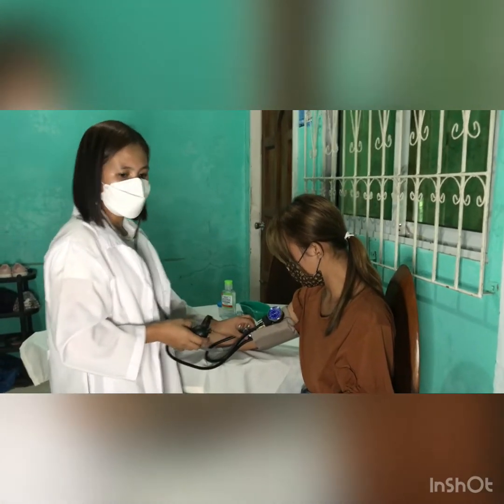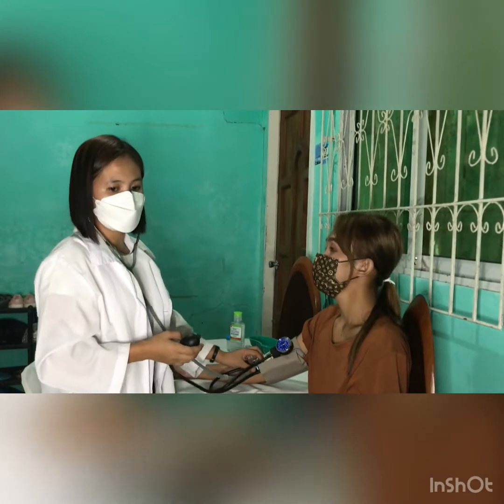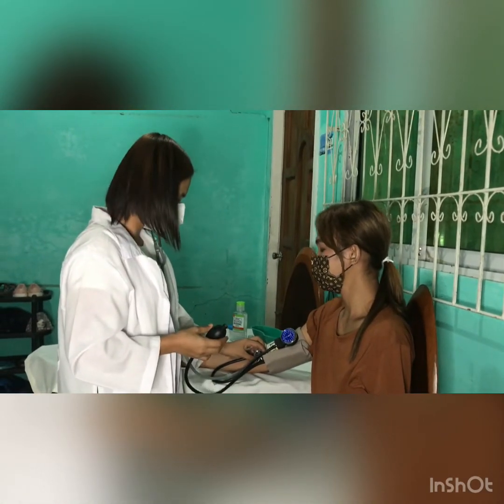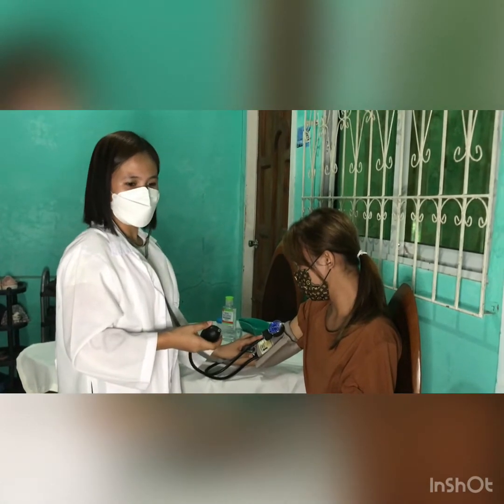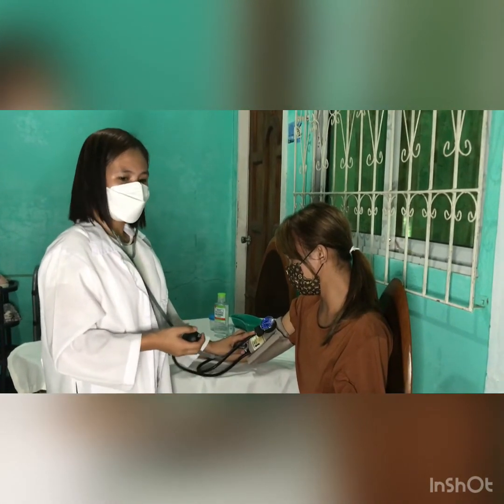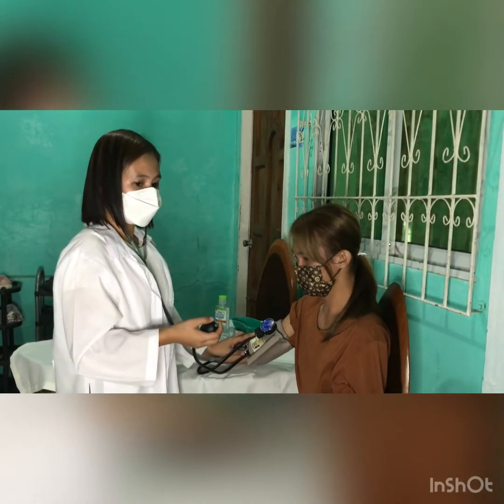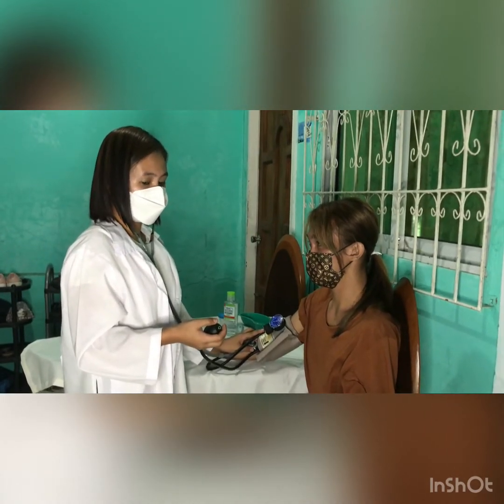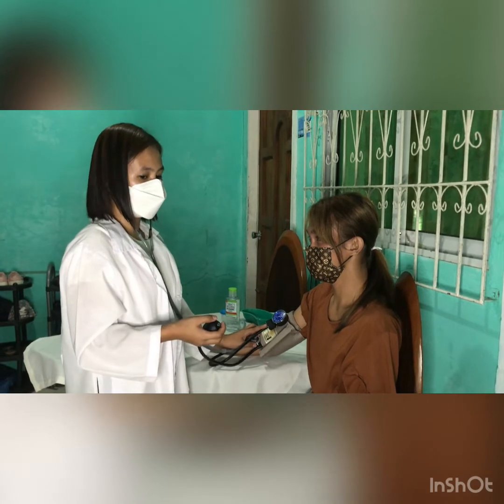Then, note the point on the manometer where the first clear sound is heard. The sound will slowly increase in intensity. Continue to deflate the cuff, noting the point at which sound is suppressed. Listen for 10 to 20 mmHg after the last sound. Then allow the remaining air to escape quickly.